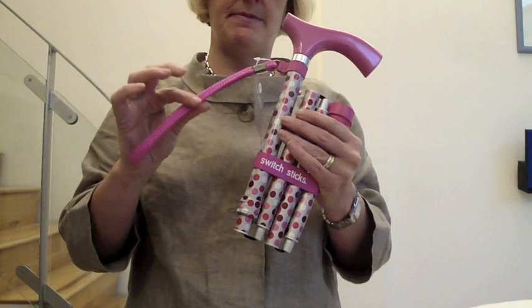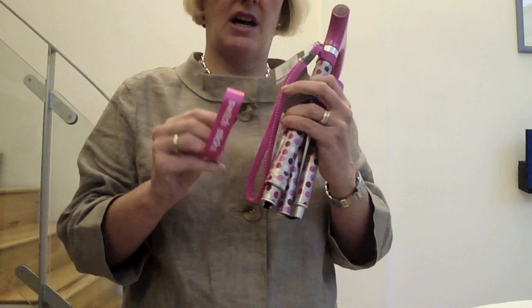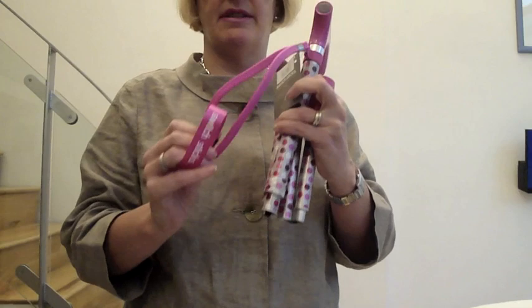The Switch Sticks comes with the wrist strap and the Velcro band. The Velcro band holds it together when it's folded. I never undo the Velcro band because it's much easier just to squeeze the stick together and pull it off. I also advise retailers to pop it onto the wrist strap if they're displaying the stick open, so that they can find it when they sell the stick.